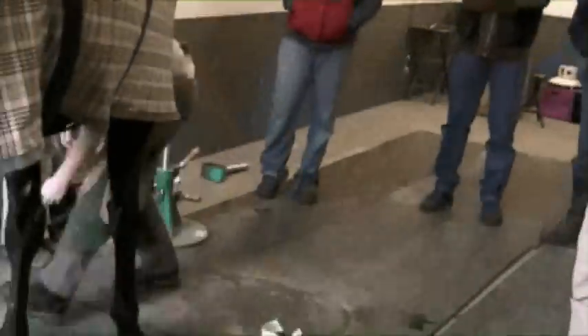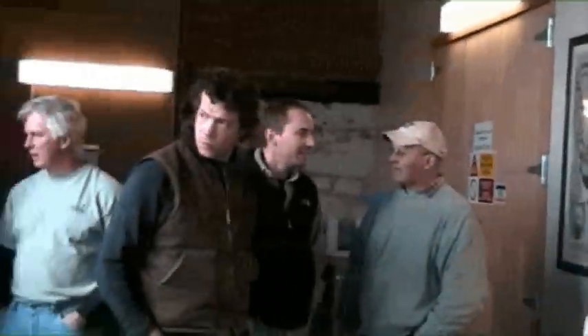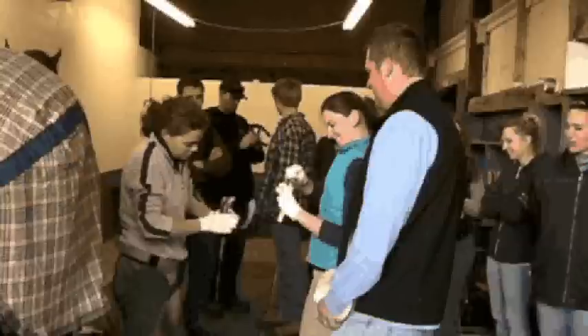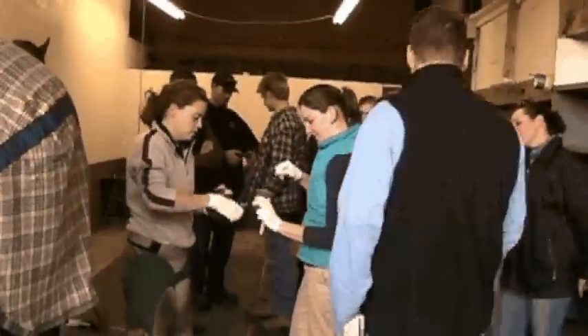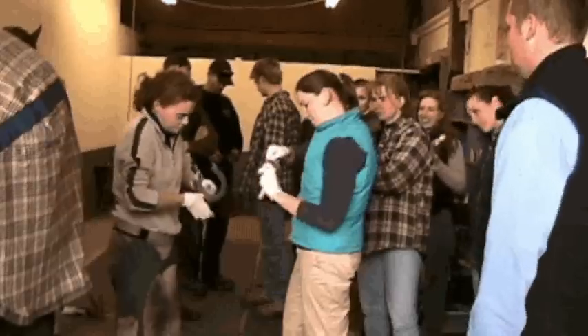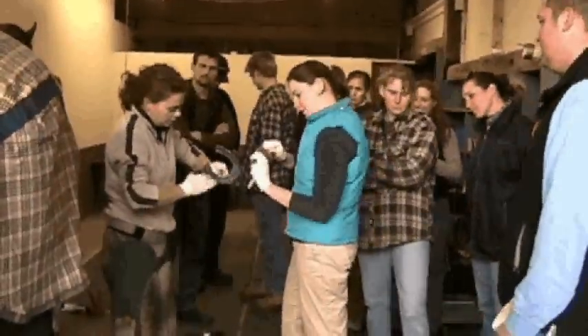Dr. Hambrook has just had the shoe shaped and she's getting her glue. The farriers are talking about the case — many of them have never seen this before. Here Dr. Hambrook is putting the glue into the mesh, really trying to saturate it and work it in. You can never have too much glue.